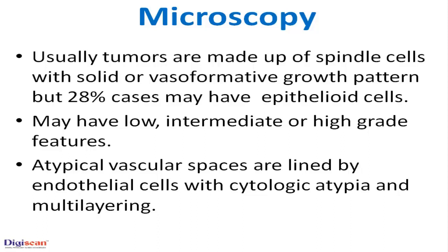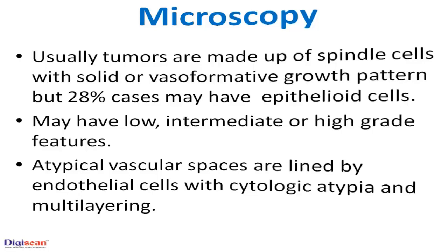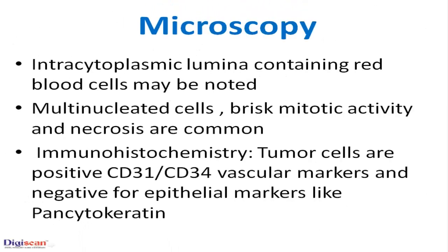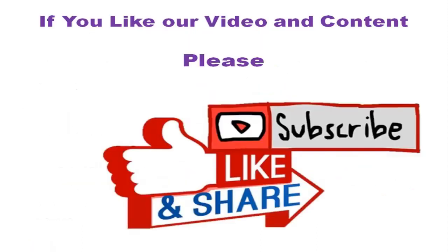Atypical vascular spaces are lined by endothelial cells with cytologic atypia and multilayering. Intracytoplasmic lumina containing red blood cells may be noted. Multinucleated cells, brisk mitotic activity, and necrosis are common. On immunohistochemistry, tumor cells are positive for CD31 and CD34, which are vascular markers, and negative for epithelial markers like pancytokeratin. Thank you.